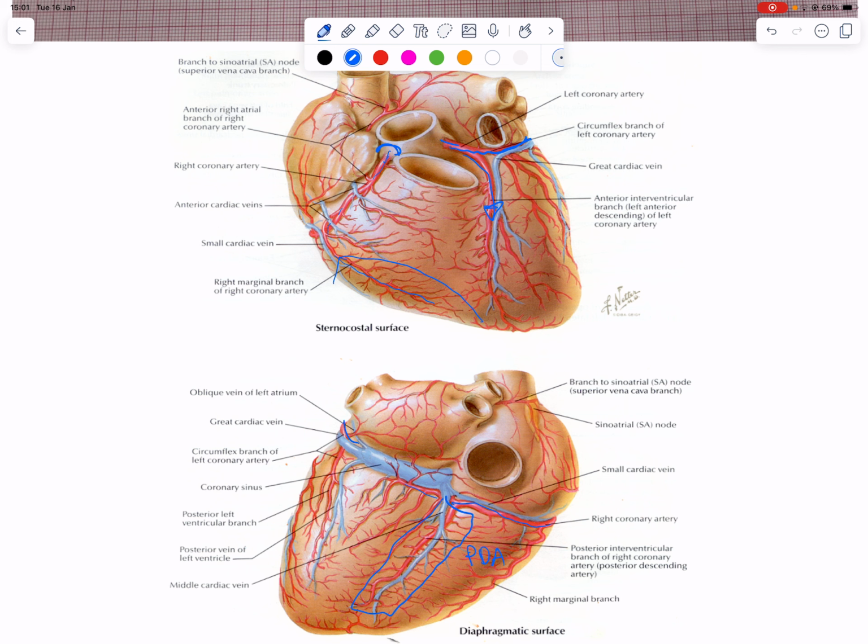So depending on where the clot is sitting, you kind of have to figure out, is this a left dominant circulation or right dominant circulation? And you can actually figure out exactly where that clot is, right? The second reason is that we can actually tell if the STEMI is a left or right dominant circulation, depending on changes that we find in an ECG, which I'll briefly explain to you guys in a bit, right?